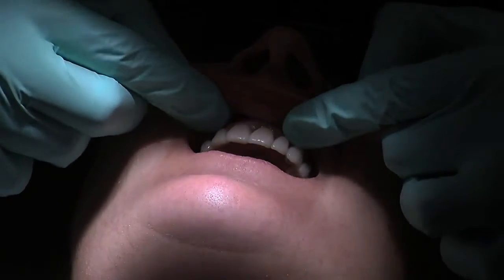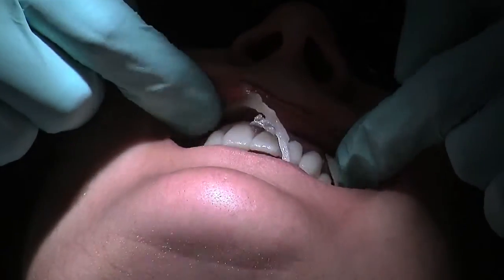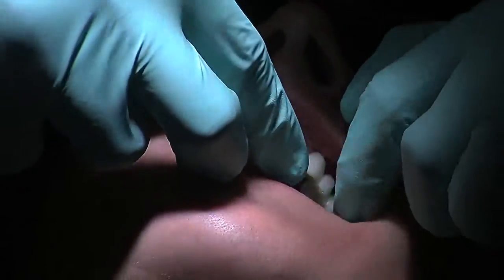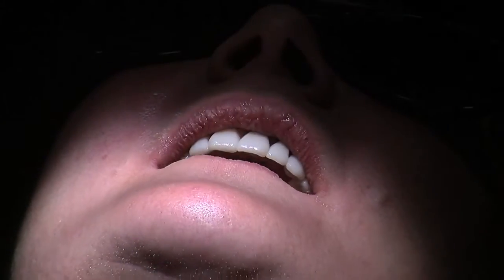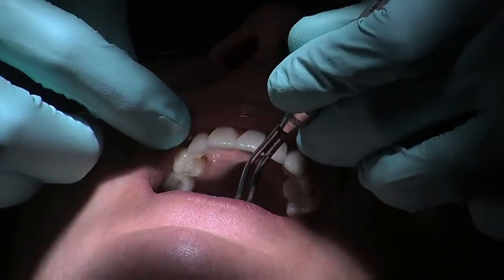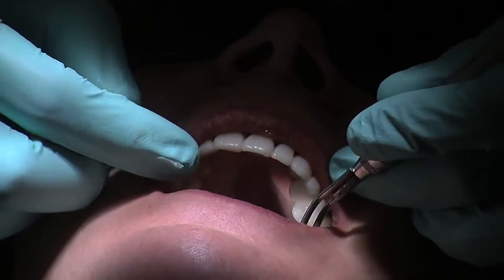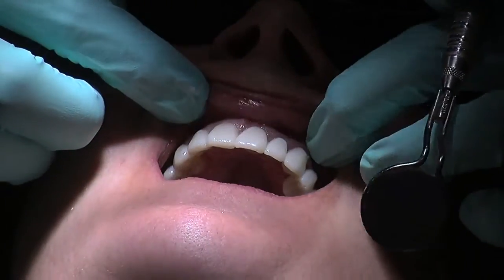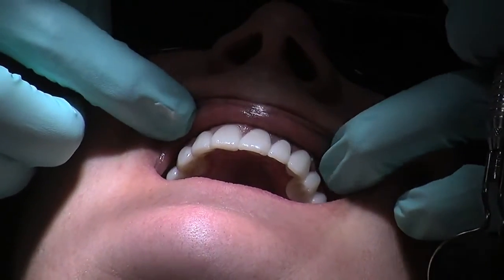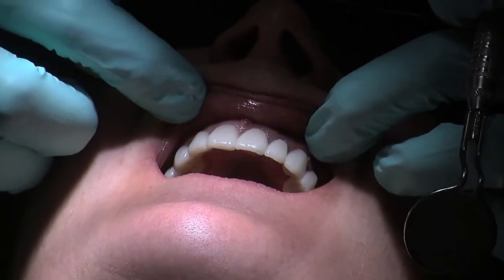And lo and behold, all beautiful white teeth in one go. You can see there's a very thin flash. All the excess has come out, which is always a very good sign that the putty index was made properly. And there's almost no flash palatally, so did a good job there. Wax-ups were excellent, and you can see now my work is going to be absolutely minimum finishing these off.